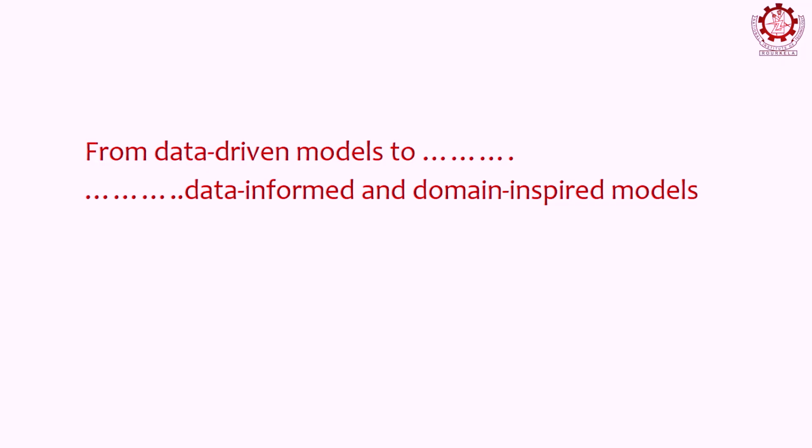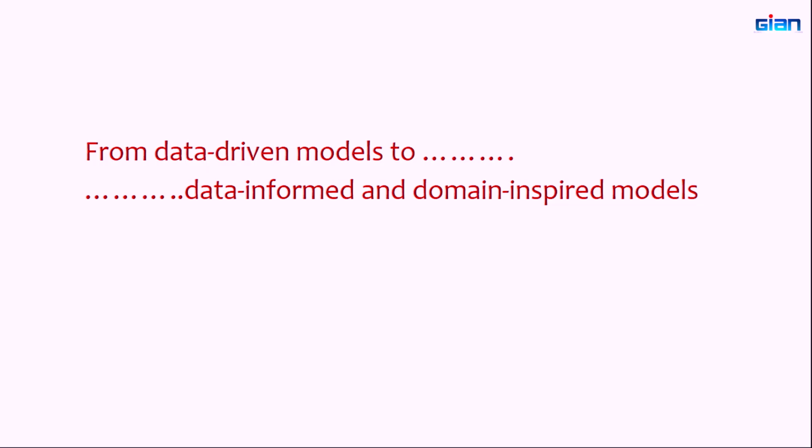So the goal that we have been pursuing in our lab is that we want to go from purely data-driven models. By purely data-driven models, what I mean is, you have your deep learning model, you have a certain architecture, you throw your data at it, you try to get your results. Even high school students can do that. We don't want to do that. So what we want to do is go from purely data-driven models to models that are data-informed and domain-inspired. By domain-inspired, what I mean is actually bringing in clinical domain knowledge. Since we are talking about medicine here, how do we bring clinical domain knowledge to training these machine learning models?